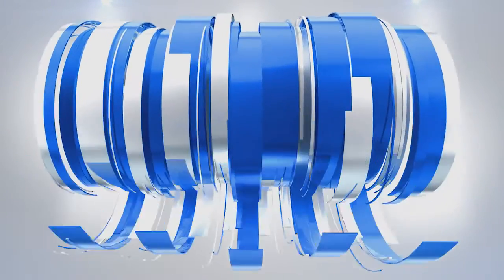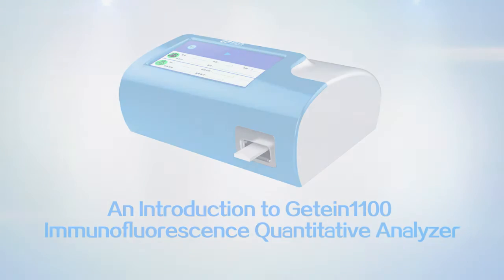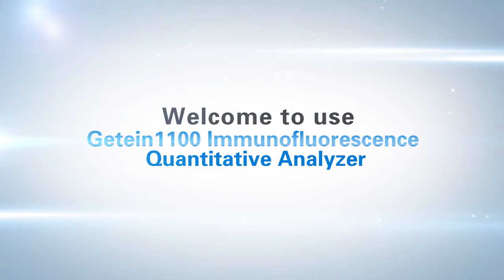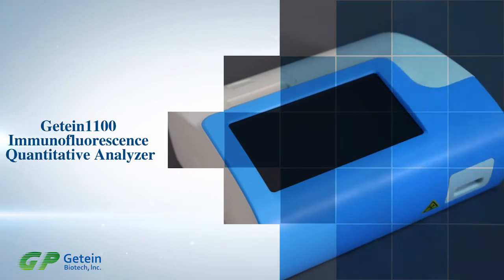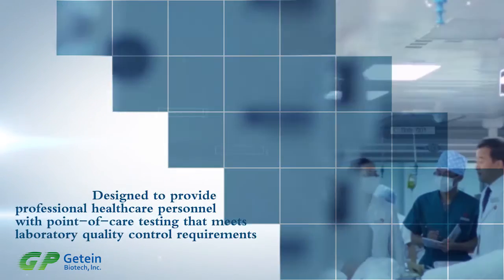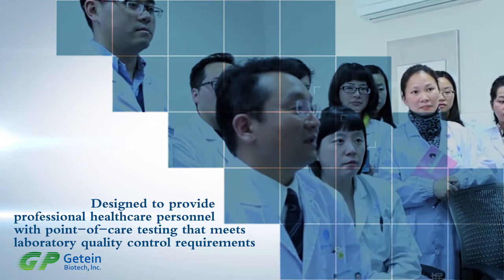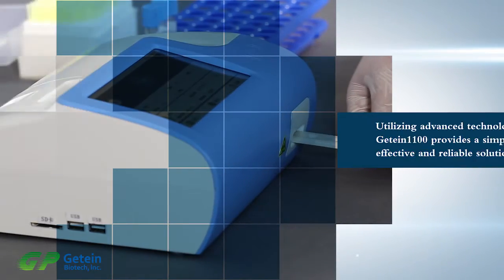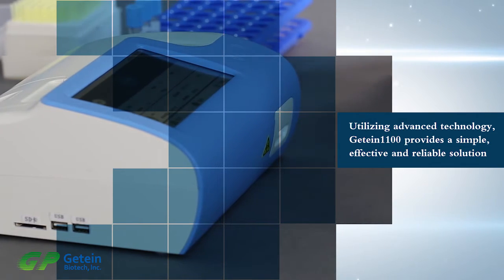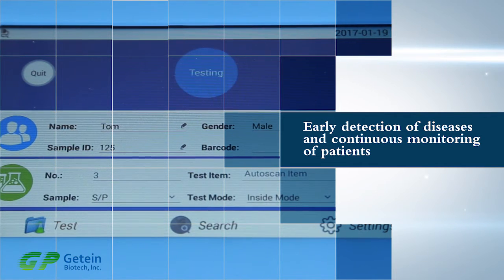Welcome to use Getein 1100 Immunofluorescence Quantitative Analyzer. The Getein 1100 is designed to provide professional healthcare personnel with point-of-care testing which meets laboratory QC requirements. Utilizing advanced technology, Getein 1100 provides a simple, effective, and reliable solution to early detection of diseases and continuous monitoring of patients.